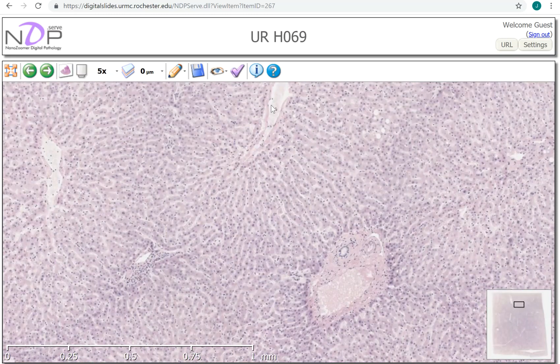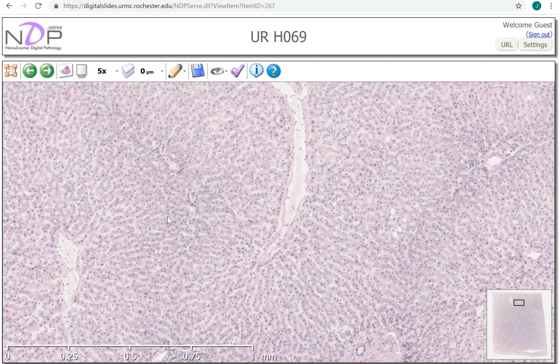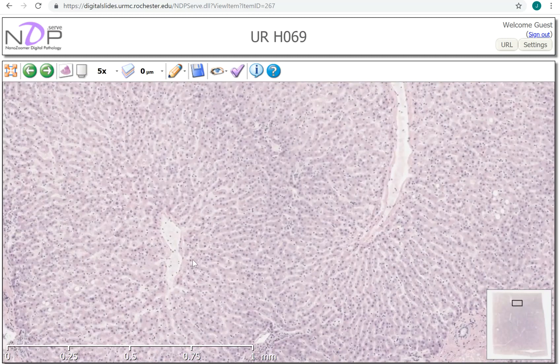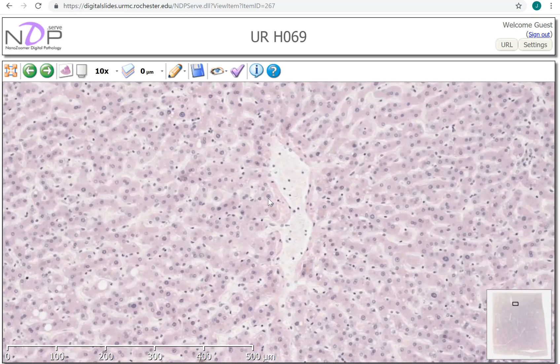Zooming out, here's an interesting structure — elongated. When we zoom in, you should ask yourself: is this a portal tract or something different? This is actually the central vein, also called the terminal hepatic venule. How do we know it isn't a portal tract? We have a large vein, which we'd see in either, but we don't have an artery and we don't have a bile duct here — it's just a venous structure.